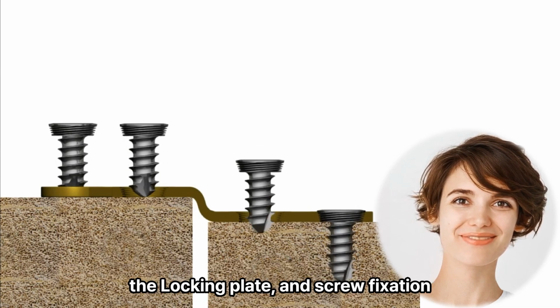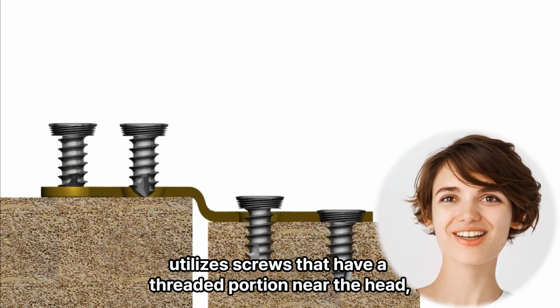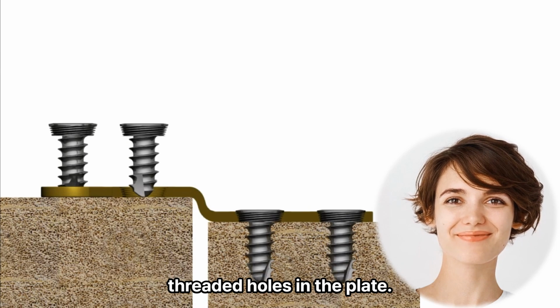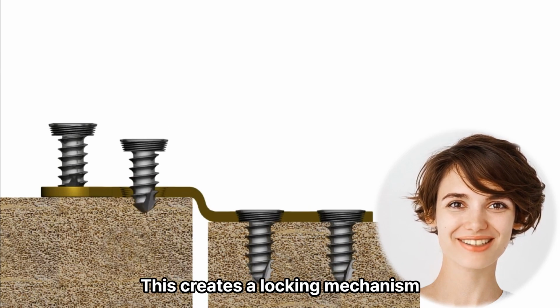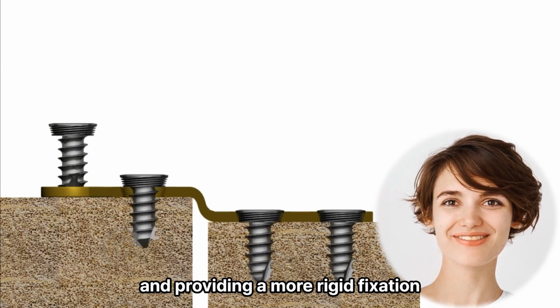The locking plate and screw fixation utilizes screws that have a threaded portion near the head, which interfaces with corresponding threaded holes in the plate. This creates a locking mechanism, preventing the screw from backing out and providing a more rigid fixation.